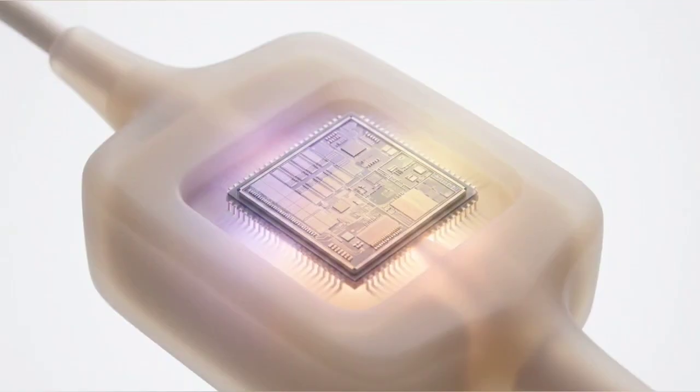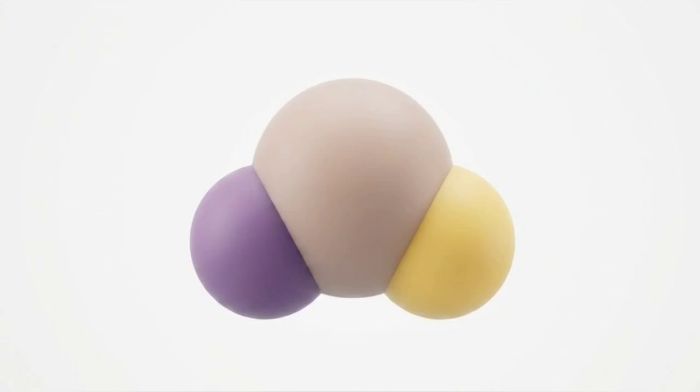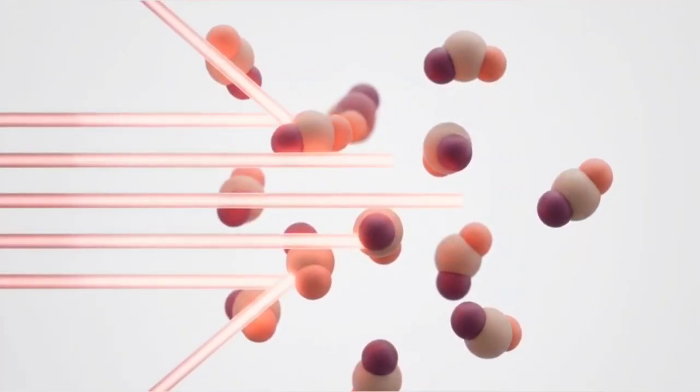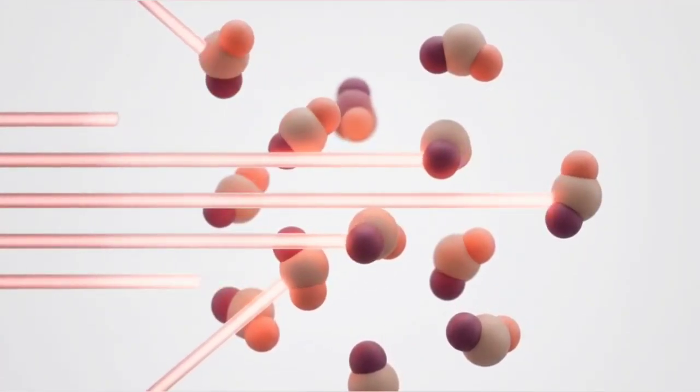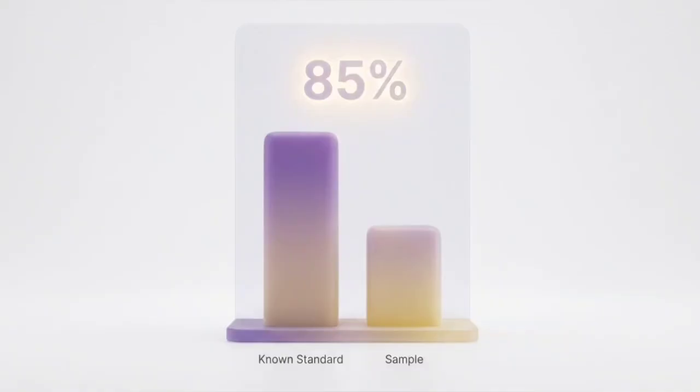Once the gas reaches the sensor, the machine must calculate the concentration. The most common technology used for this, especially with side stream sampling, is infrared analysis. Gases with 2 or more dissimilar atoms have specific infrared light absorption spectra. When a broad spectrum of infrared light is beamed through the sample, carbon dioxide molecules absorb very specific wavelengths. The machine determines the concentration by comparing the amount of light absorbed against a known standard.